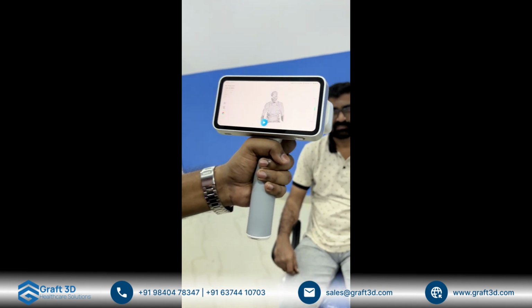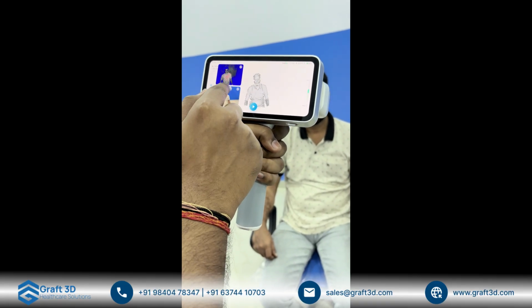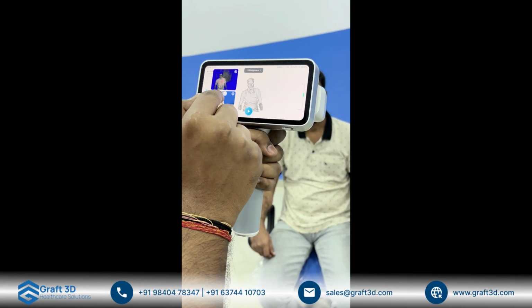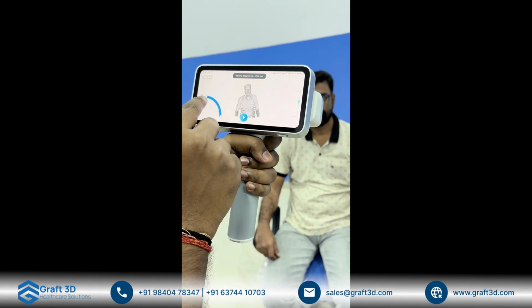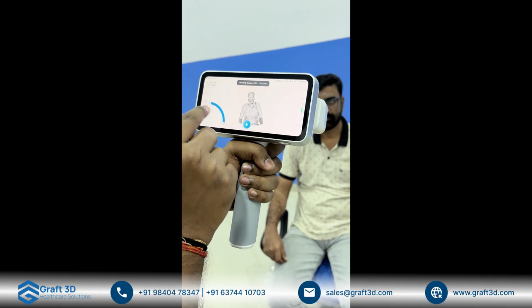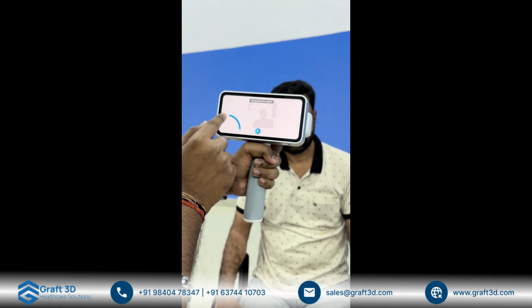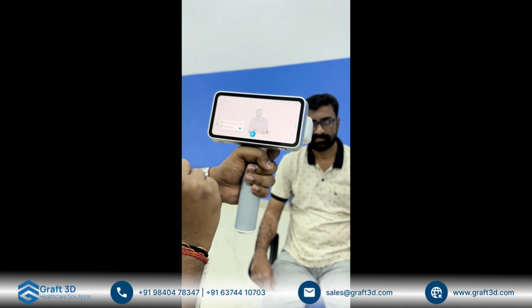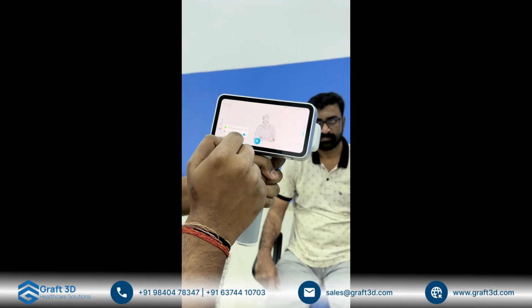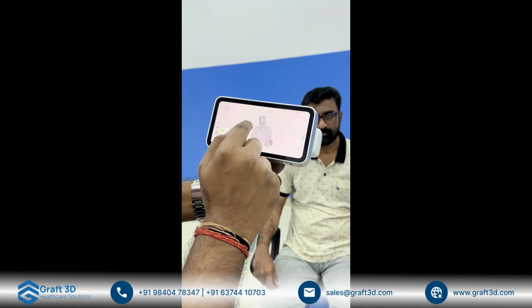This is how we'll be scanning it. If you want to increase the brightness or the saturation level, we can directly do it with the help of this. We'll click on auto. We'll scroll it down. We have the working distance. If I want to work with a very near one, I can just reduce the working distance. And if I want to increase the working distance, I can do that as well. Data quality indicator, we can check the quality of the data while scanning it. So it will give us a preview for scanning as well.